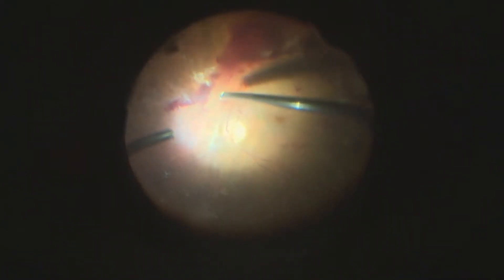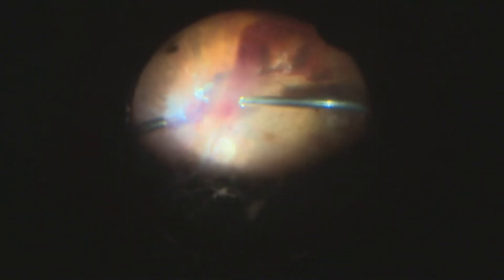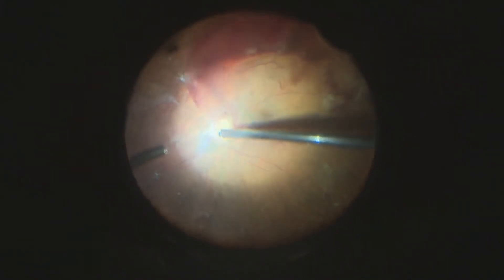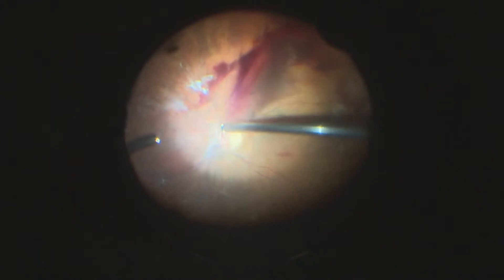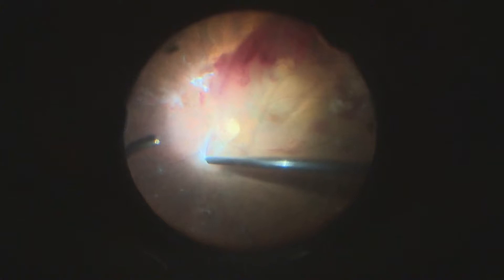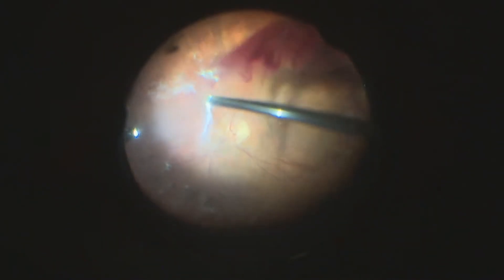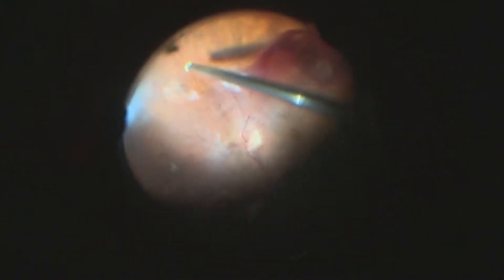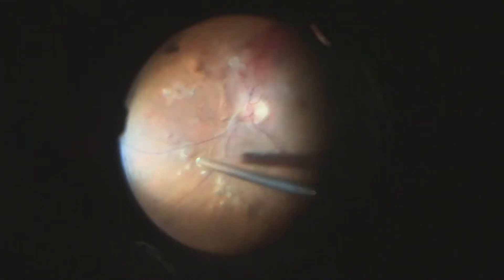There is one peculiar thing about this case — the pan-retinal photocoagulation. We don't use the DRS protocol, due to the fact that the first ring from the DRS protocol causes vitreoretinal adhesion at the posterior pole and also extensive reduction of the visual field. So our protocol is called external ring photocoagulation. It starts at the ora and stops at the vortex veins. We do coalescent laser, not scattered laser. We do retinal ablation and we treat non-perfusion, contrary to the DRS study that treats hemorrhages and exudates starting from the posterior pole to the equator.